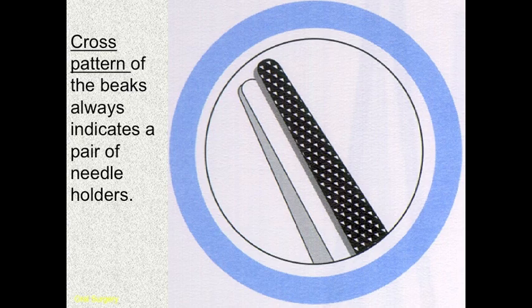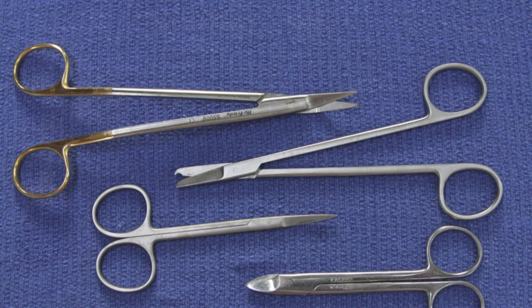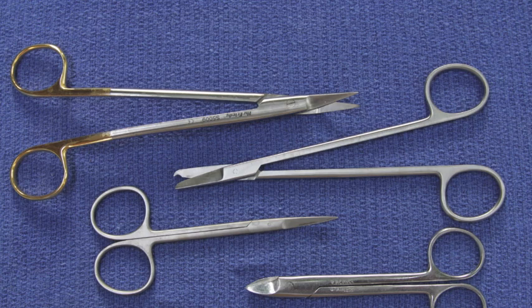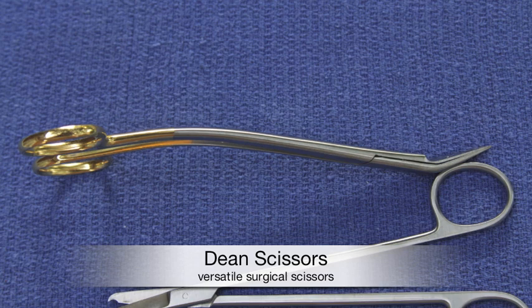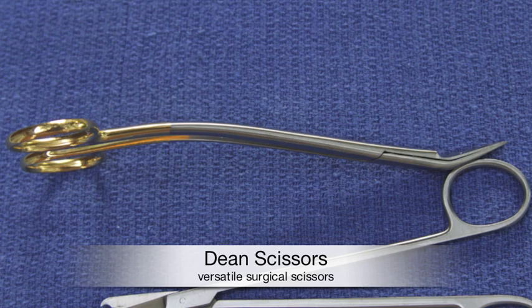Each one has their own use, and in a surgical environment, it is important to make sure that the proper instruments are being used, those of surgical scissors, particularly, as you will find commonly used in dentistry, iris scissors, and then also Dean scissors. There are many, many different kinds of scissors found in dentistry, and so when you set up your tray, allow for the full-time assistant to help you find the appropriate scissors to be used.